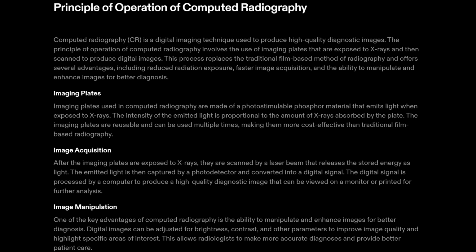The process replaces traditional film-based radiography and offers several advantages, including reduced radiation exposure, fast image acquisition, and the ability to manipulate and enhance the images for better diagnosis.